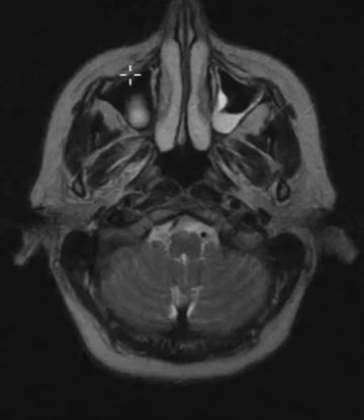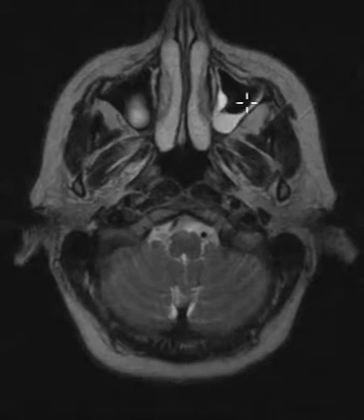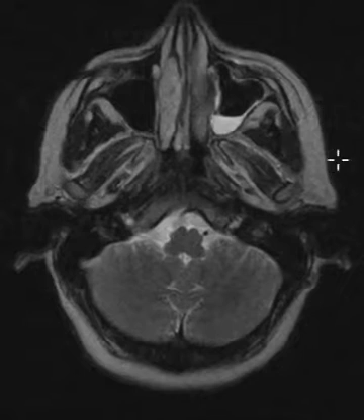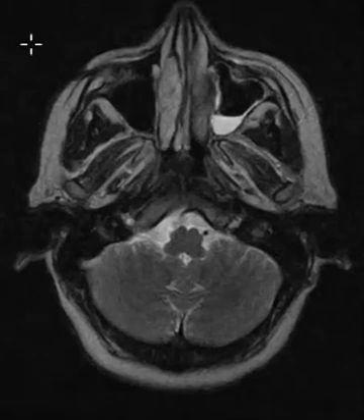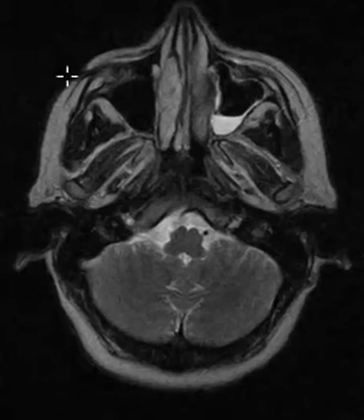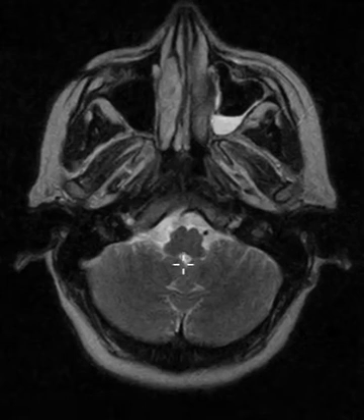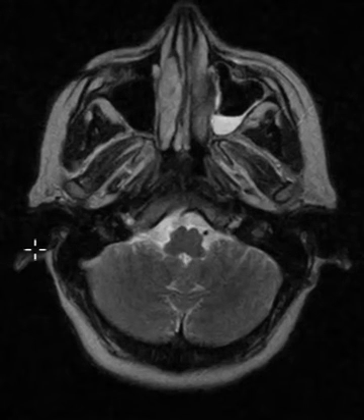This is the right maxillary sinus and this is the left maxillary sinus. Air, as you can see outside the body, is dark — it should be dark like in the right maxillary sinus. This is the nose to get oriented, this is the cerebellum in the back, and here are the ears on the left and right side.